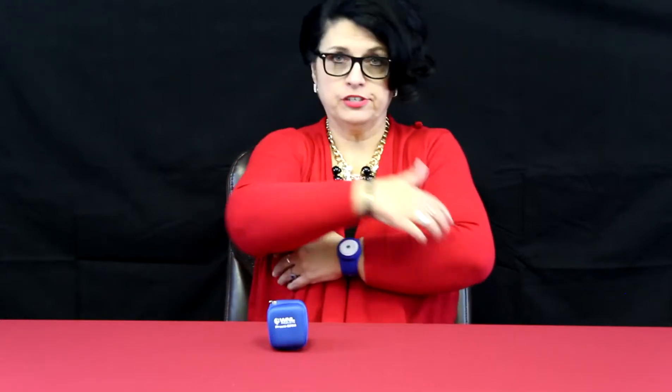One thing I wanted to tell you is that the on and off button, which is small — you may not be able to see it — since I do these videos pretty much by myself, it's hard to zoom in and zoom out. So, this on and off button faces your elbow.